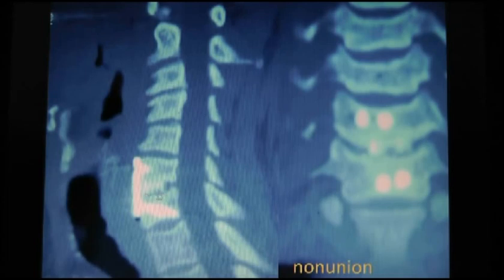This? I think this is allograft. Just it's so dense anteriorly there. You may be right, but I think it's allograft. But what else? But right where the cursor marker is, there's lucency. So there, it has not fused. So this is a non-union. See where the bones didn't come together? So this is a case of a non-union.